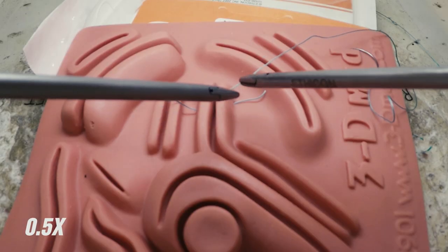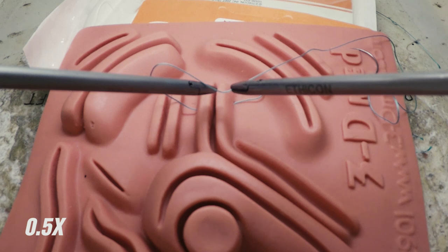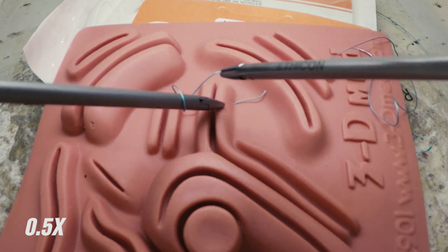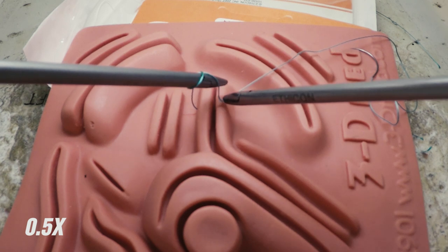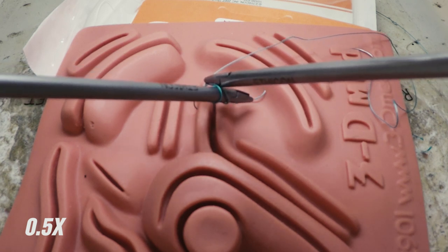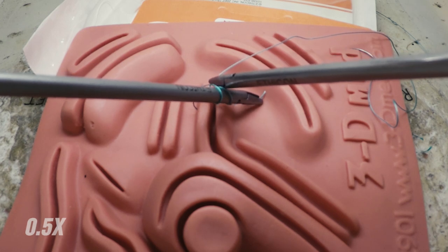Rotate the loop by supinating. Now rotate the loop back down toward the tissue by pronating, and this will create your first throw. Repeat the exercise to create a surgeon's knot. Grasp the tail with your hand pronated so that if your tail gets stuck in the knot, you can supinate your hand to flip the tail out.